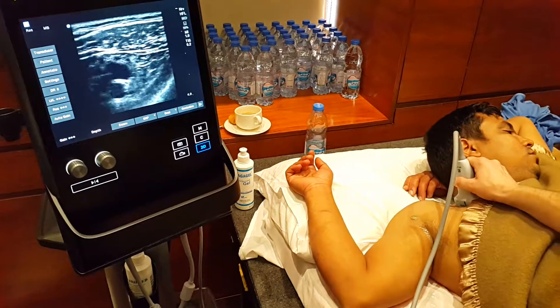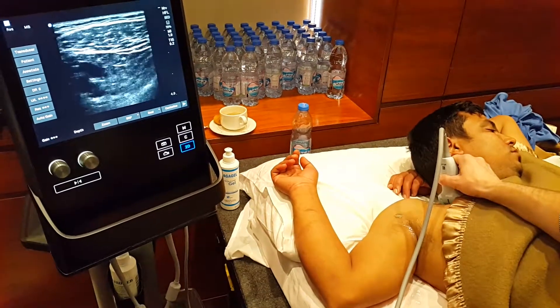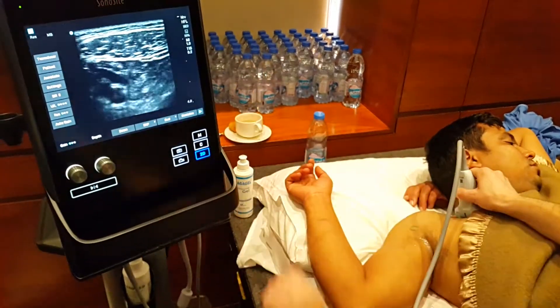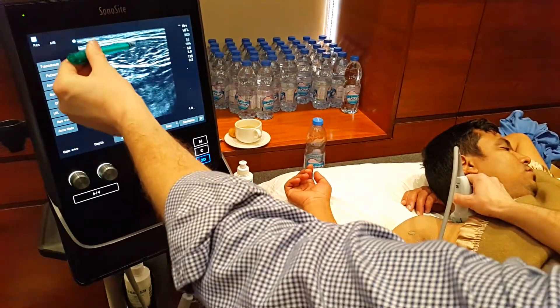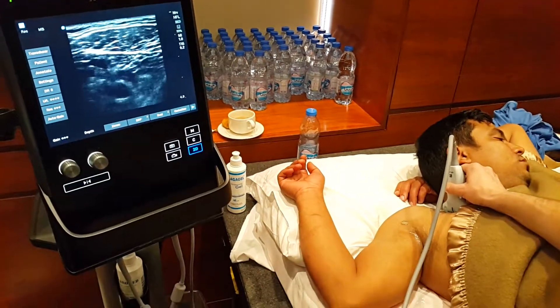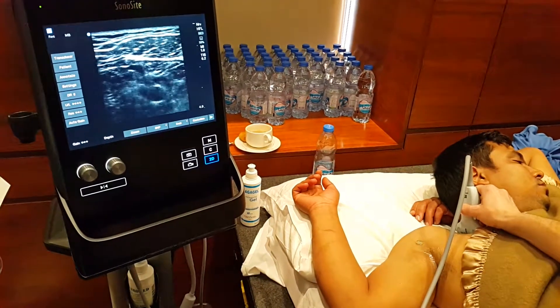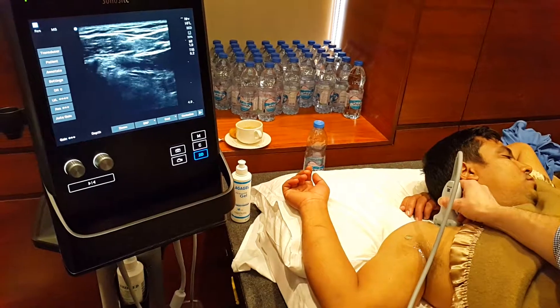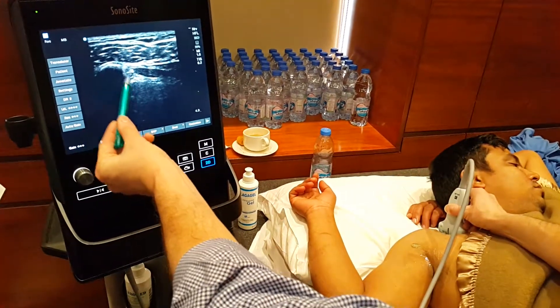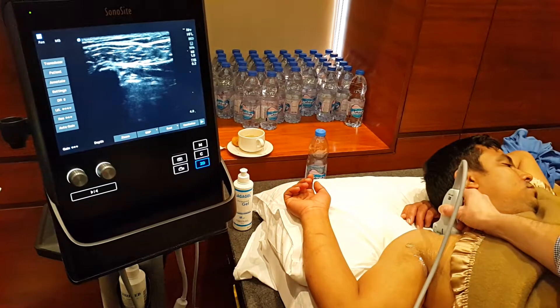If I just put the probe in the mid part of the chest, immediately you can see here we've got a big pec major muscle overlying the chest. I'm going to come a little bit higher up and a little bit laterally. So you can see here there's a shadow of the coracoid process.